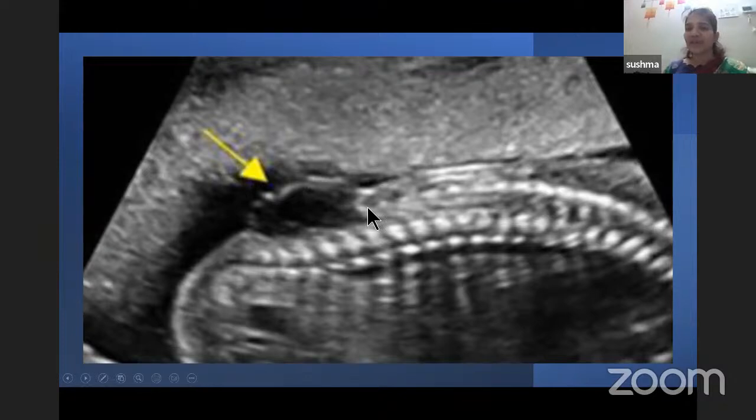So earlier, I was under the impression that closed neural tube defects do not have a surface swelling like this, but that was not correct. Open and closed are only differentiated by the presence of skin, and skin is difficult to make out on ultrasound. So the only thing that tells us that it is an open neural tube defect is the indirect signs present in the brain. So we can still miss a closed neural tube defect if we only rely on the brain.